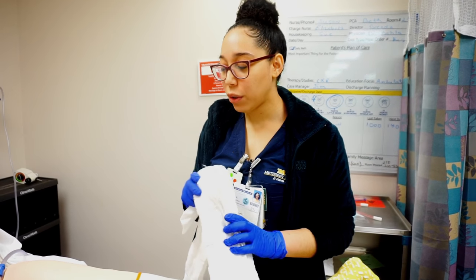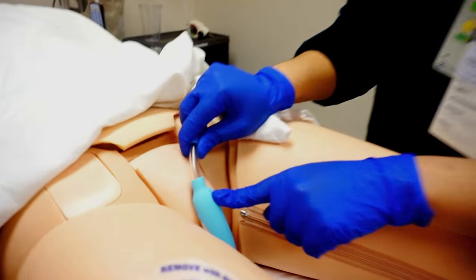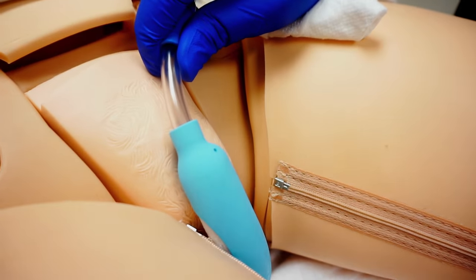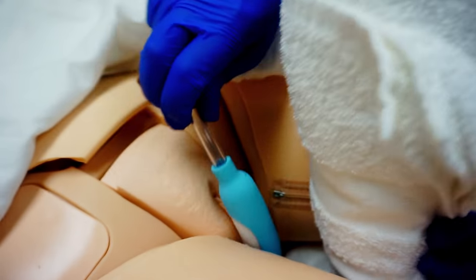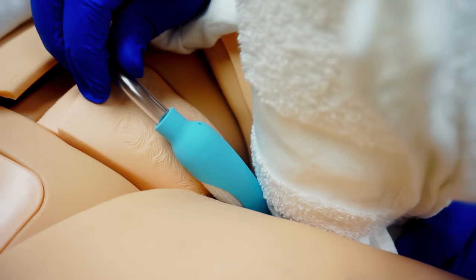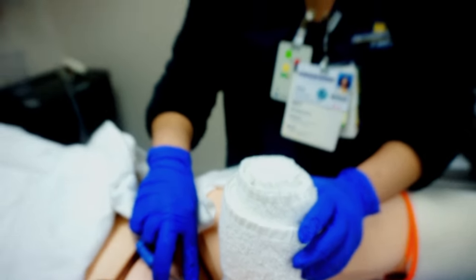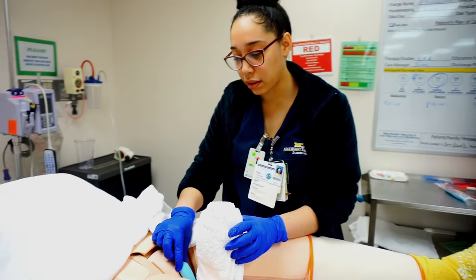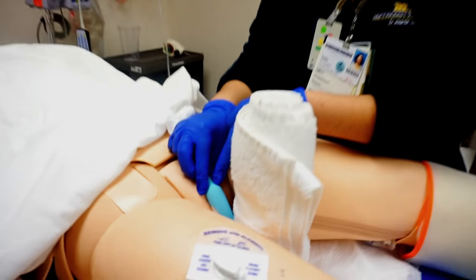If you have a patient who is overweight and you notice that this opening right here is covered, you can put a towel right here to keep their legs separated. This will keep this little hole exposed. The reason we need to have this open is because it is part of the overall suctioning of the Purewick — if it is covered, it won't suction.